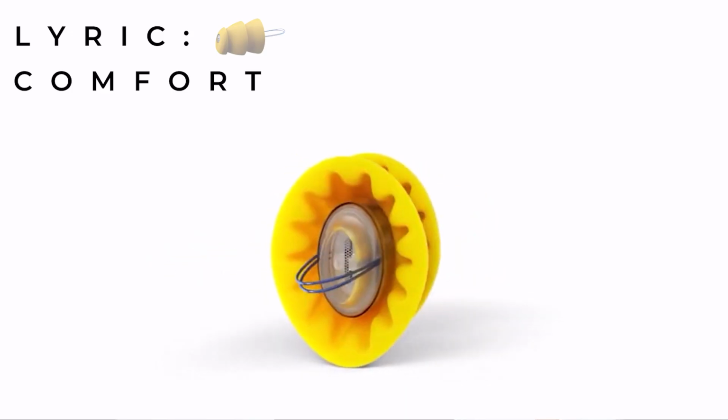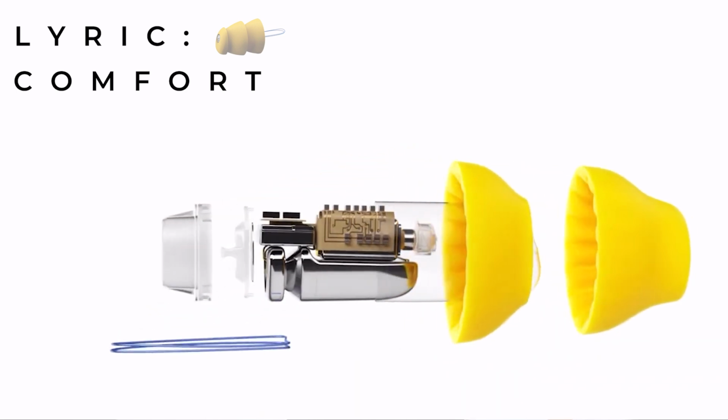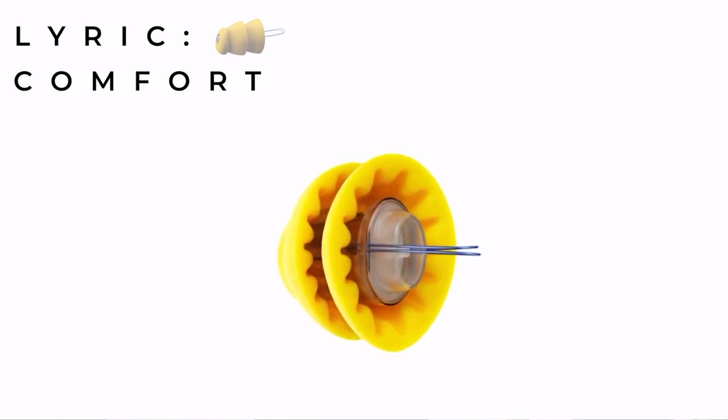You should be able to see two little threads on the outside, which are then used when the Lyric needs to be removed. Underneath those bright yellow seals, we have the rest of the components, which include the cleverly rolled printed circuit board, amplifier and battery.